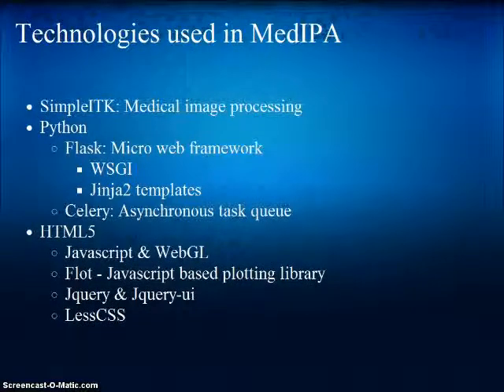So the MedIPA system used a wide variety of technologies to achieve both server and the client-side components, which will be covered a little more in-depth in a review of the architecture.